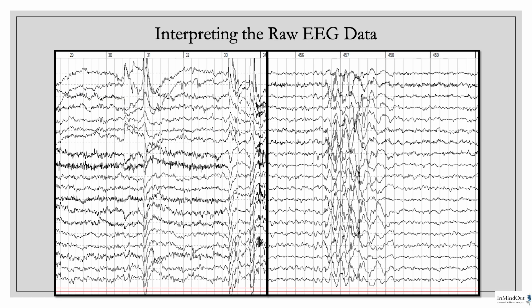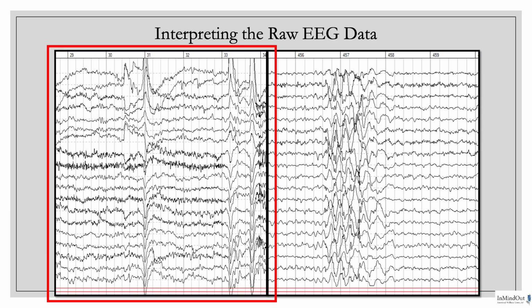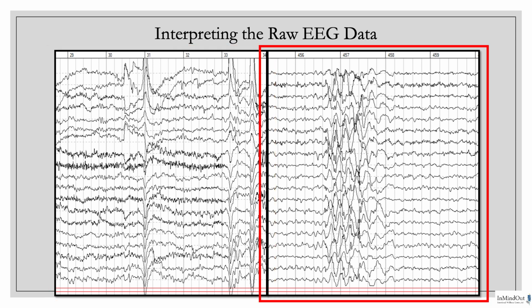This is what an EEG would look like. The QEEG starts with the electroencephalogram, and you need to distinguish which of the images or which of the activity that you have in front of you corresponds to real brain activity. This here on the left is just eye blinks and muscle tension, and this to the right is an epileptiform discharge, an epileptiform paroxysm. And you will learn to read this, you will learn to interpret it, and you will learn to refer to the proper professional, but also to create brain training neurofeedback protocols to help the person.